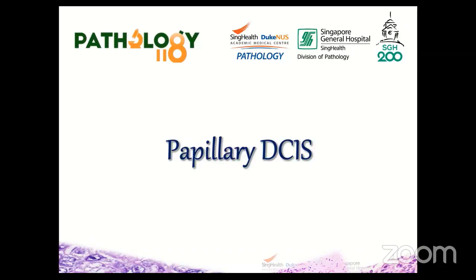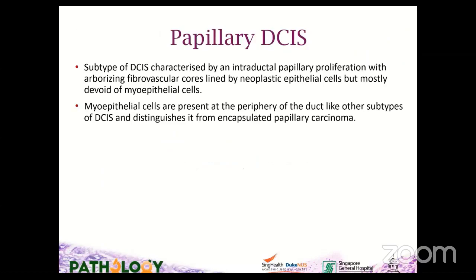Our next topic is on papillary ductal carcinoma in situ. Papillary DCIS is a subtype of ductal carcinoma in situ characterized by an intraductal papillary proliferation with arborizing fibrovascular cores lined by neoplastic epithelial cells, but mostly devoid of myoepithelial cells along the fibrovascular septa.